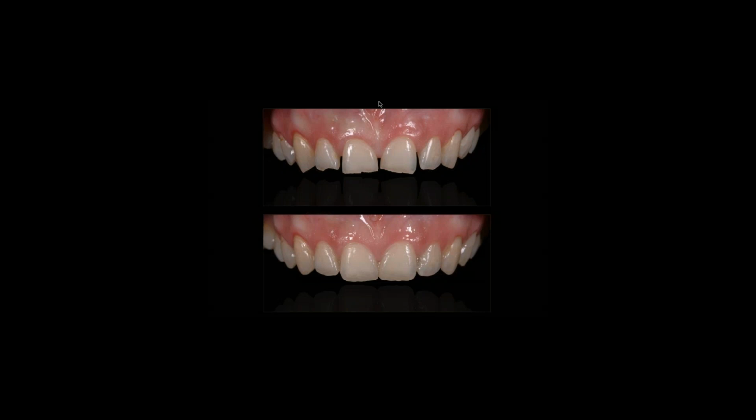And actually, this is what I always do. The wax up is mandatory in my protocol, and I always do the wax up.